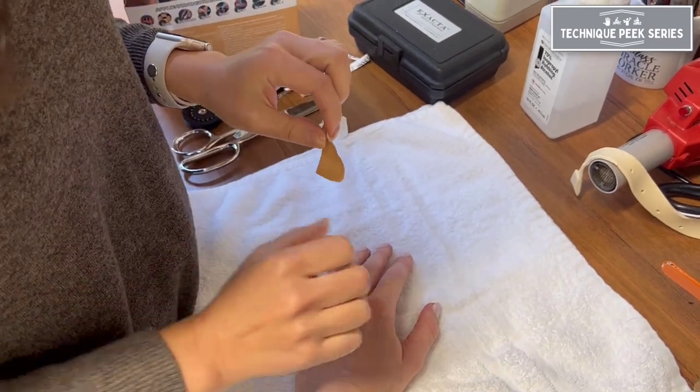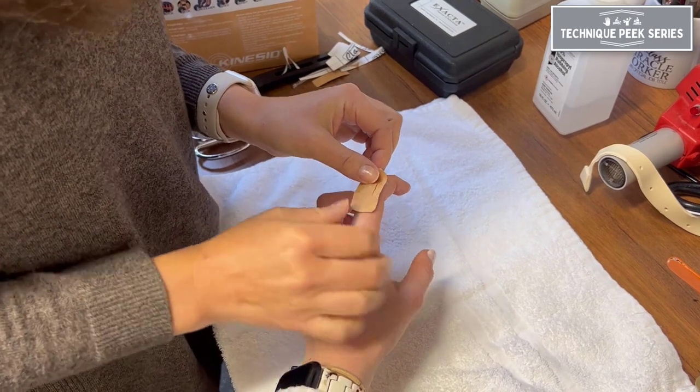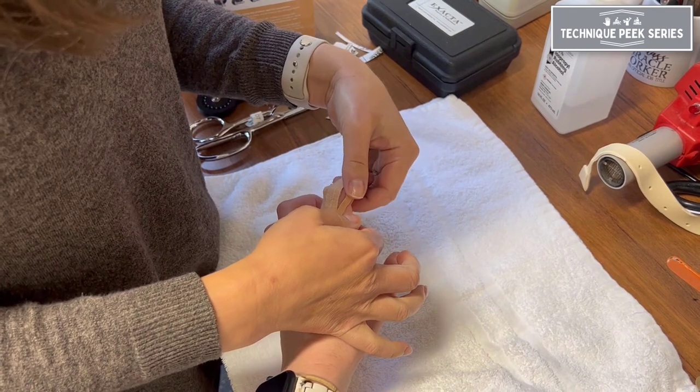Though it is not shown here, you'll want to prepare your skin by cleansing it with rubbing alcohol and removing any lotions or oils on the skin to ensure better adherence of the material.